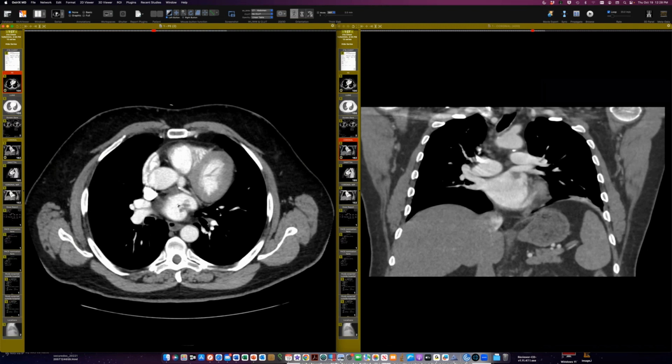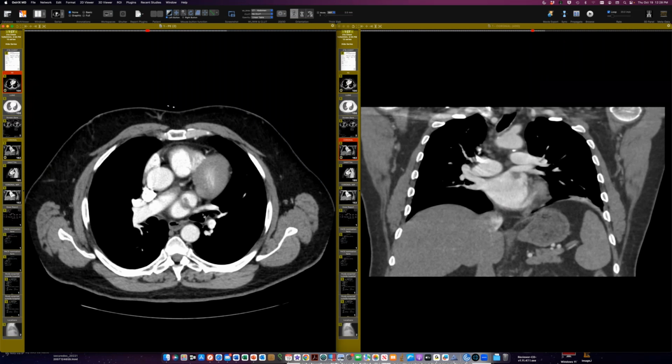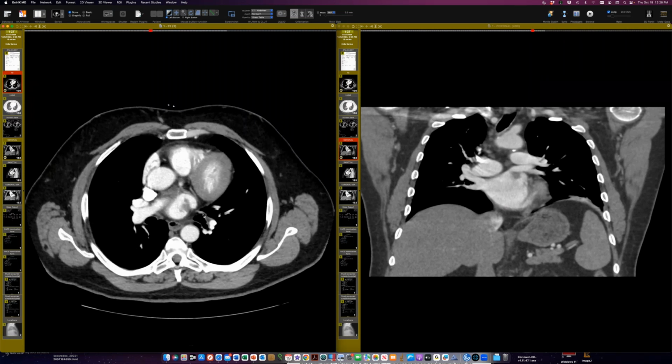Seth, doesn't this look sort of more irregular than a muscle band? I would expect a muscle band to be smooth and linear, and this thing looks polypoid. If it's just that linear part, it wouldn't bother me, but what bothers me a little is the inferior aspect, where it's more papillary frond-like. That's why I'm suggesting that. If we had really thin slices and could see little bands of muscle extending across to the other side of the atrial wall, maybe. Okay, I think Karen's probably right. I personally would probably get something to confirm.